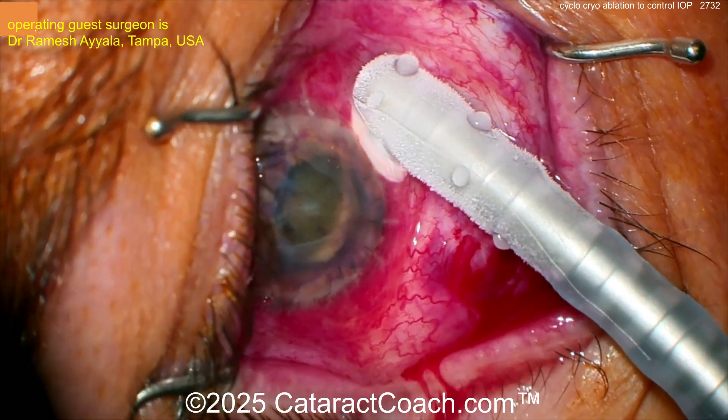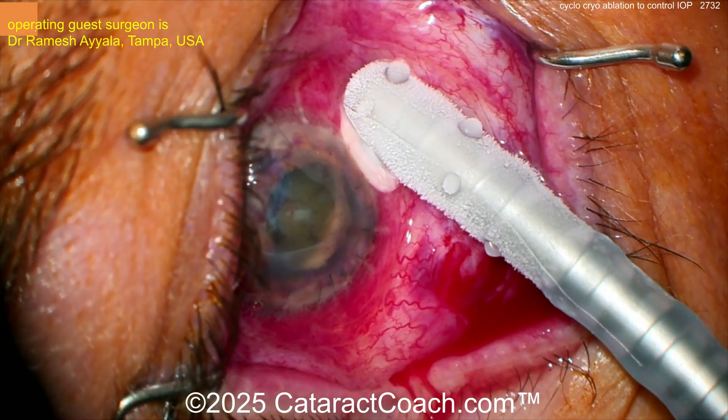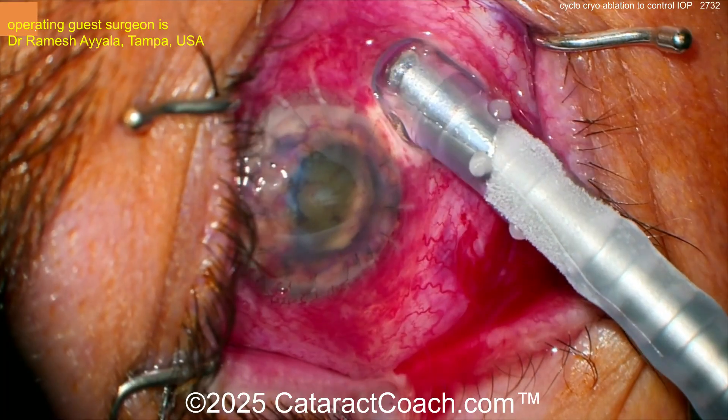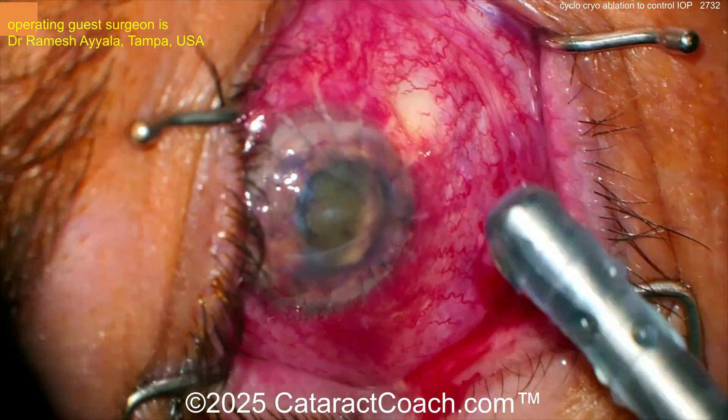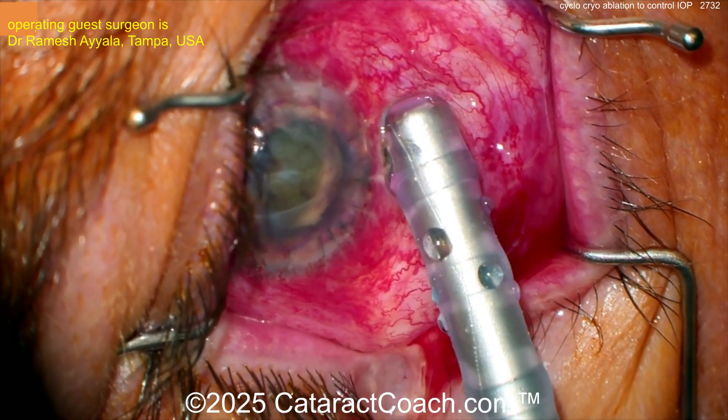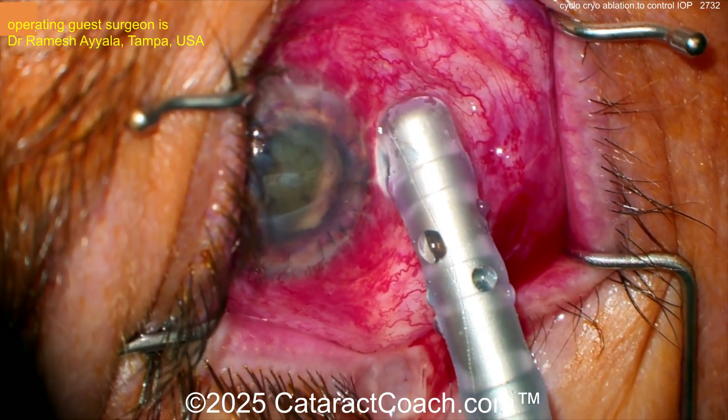The two-millimeter probe is placed one millimeter behind the limbus. You want to count for 30 seconds at a time. The video here is sped up, so don't count on that — 30 seconds and then let go. And there you go, that's one spot.